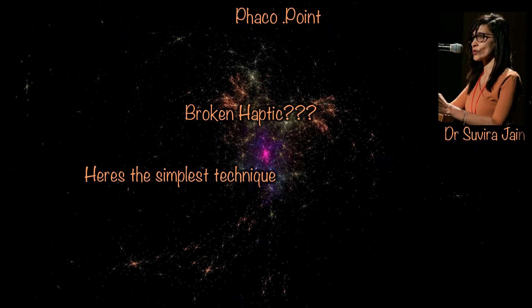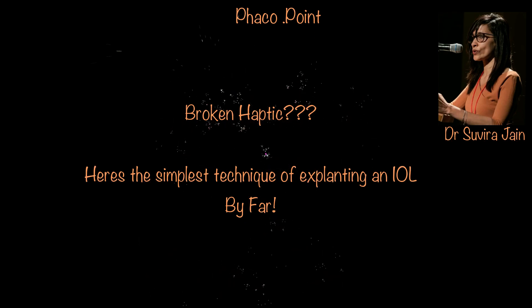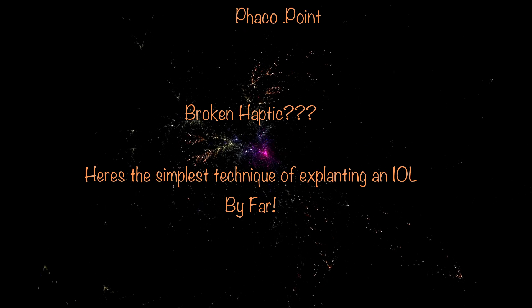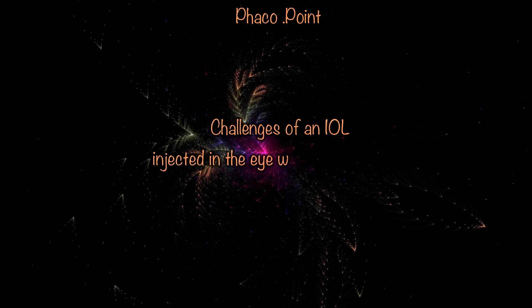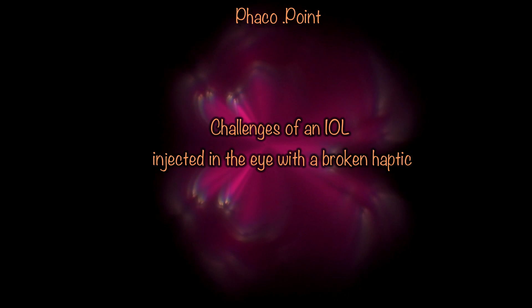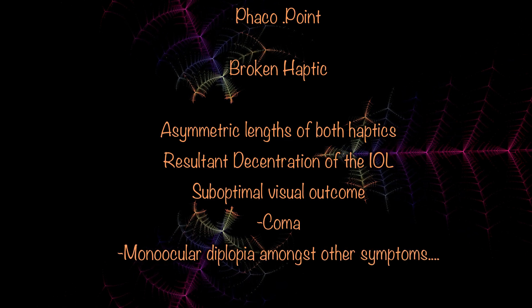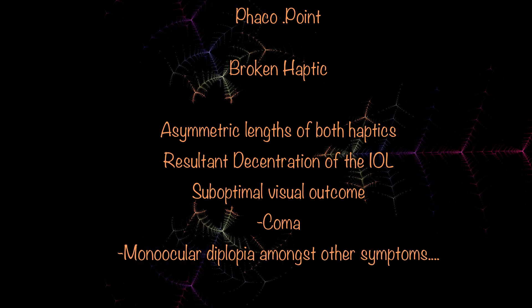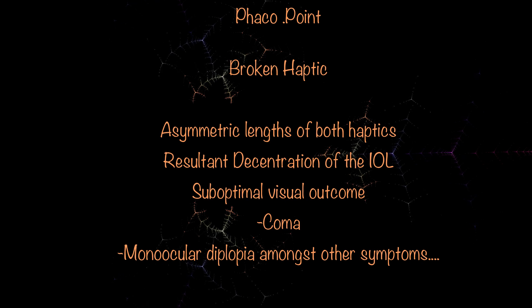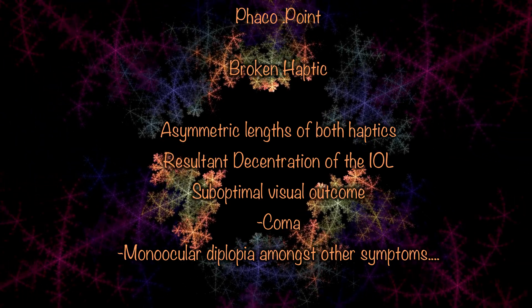Here's a thought. What could be worse than at the end of a fairly uneventful, elegant phacoemulsification, you end up injecting the IOL only to find that upon completion of the injection, its trailing haptic is missing? This becomes a real problem because you can't leave the IOL like this with a broken haptic in the eye. An IOL with unequal haptic lengths is unlikely to centre well in the bag or the ciliary sulcus, and is almost certain to decentre, causing significant visual symptoms because of the induced coma.